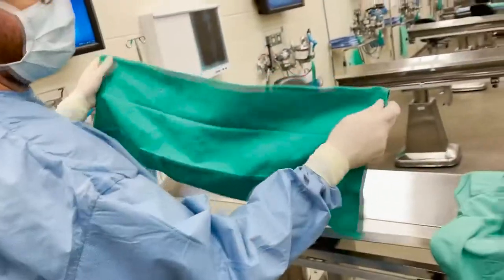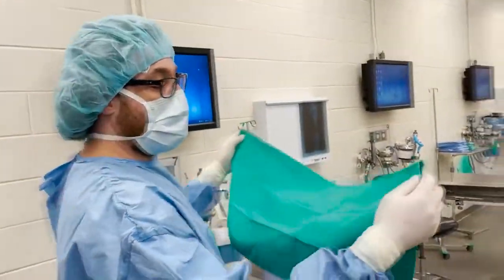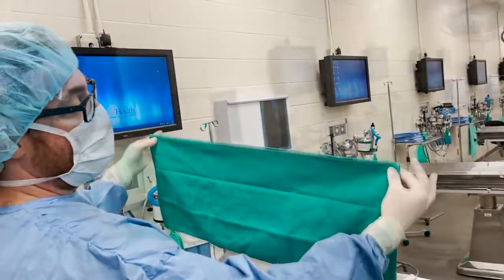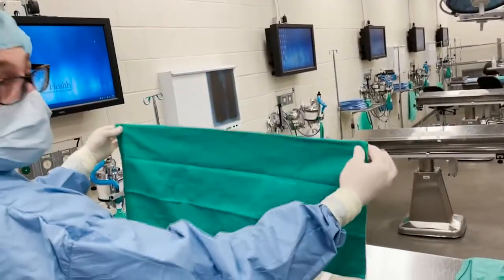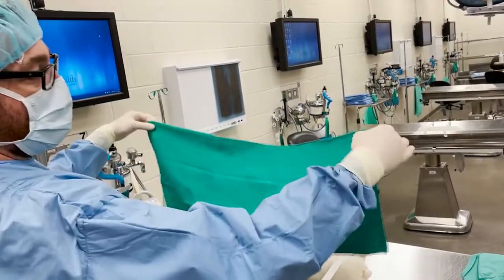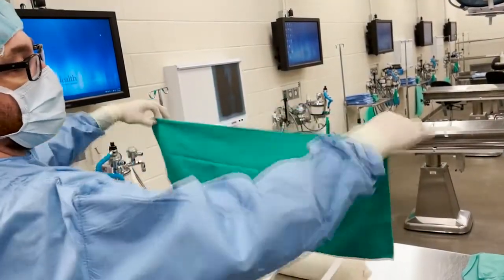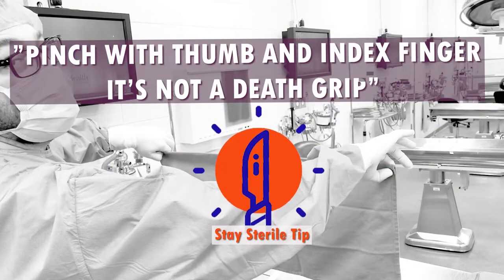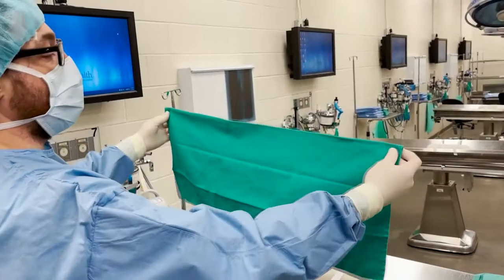If you finish a prep and notice that you've got a folded edge up, it means you put it down backwards — it's not the end of the world, not ideal for sterility. I've got my fold away from me, and I'm going to pinch with just finger and thumb — not a death grip. When I rotate, I'm not moving the towel; I'm able to move my fingers around while keeping the towel in the same place.